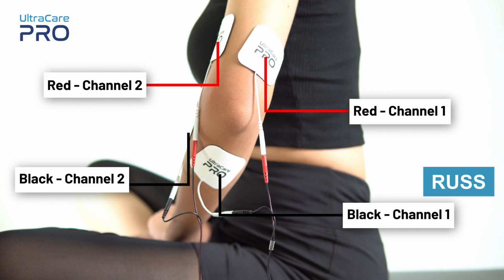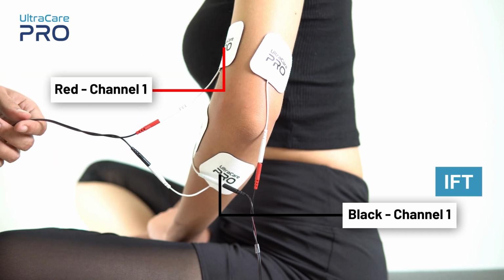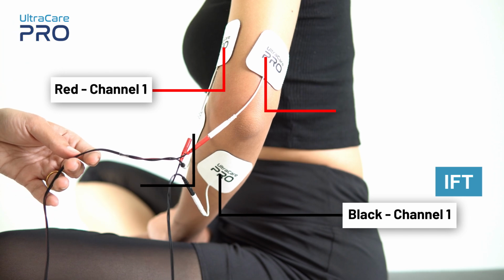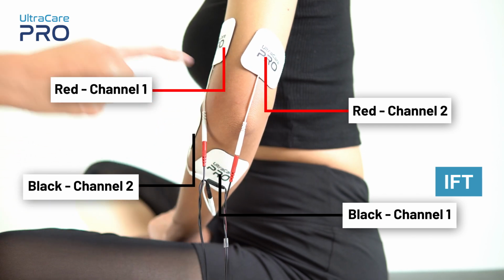For IFT application, place red and black electrode from channel 1 diagonally opposite to each other, surrounding the elbow region. Similarly, place red and black electrode from channel 2 diagonally opposite to each other in a way that a cross pattern is formed and a painful area is covered well.